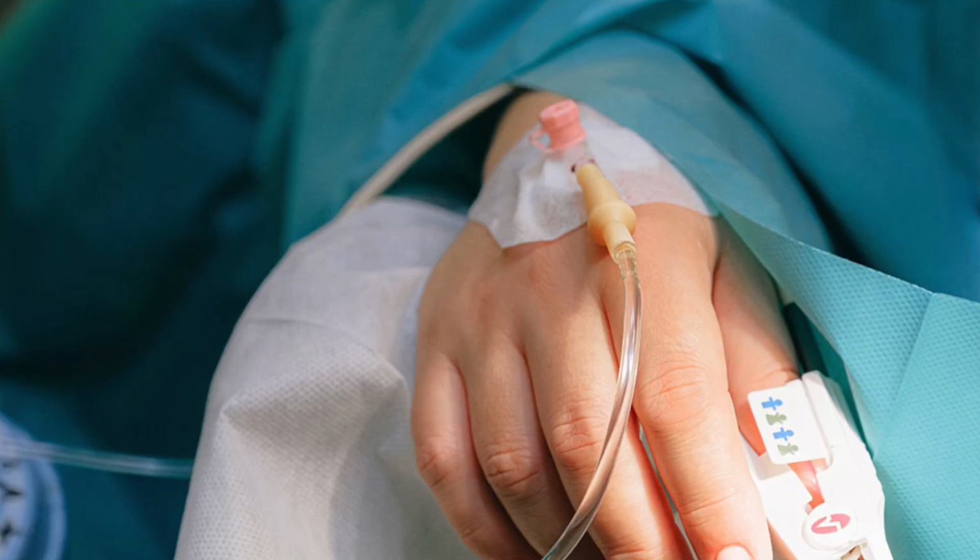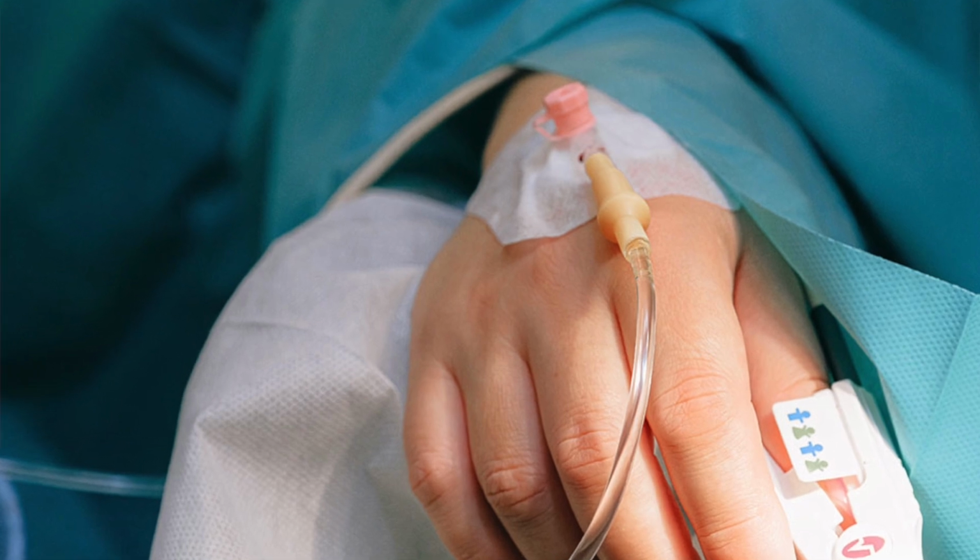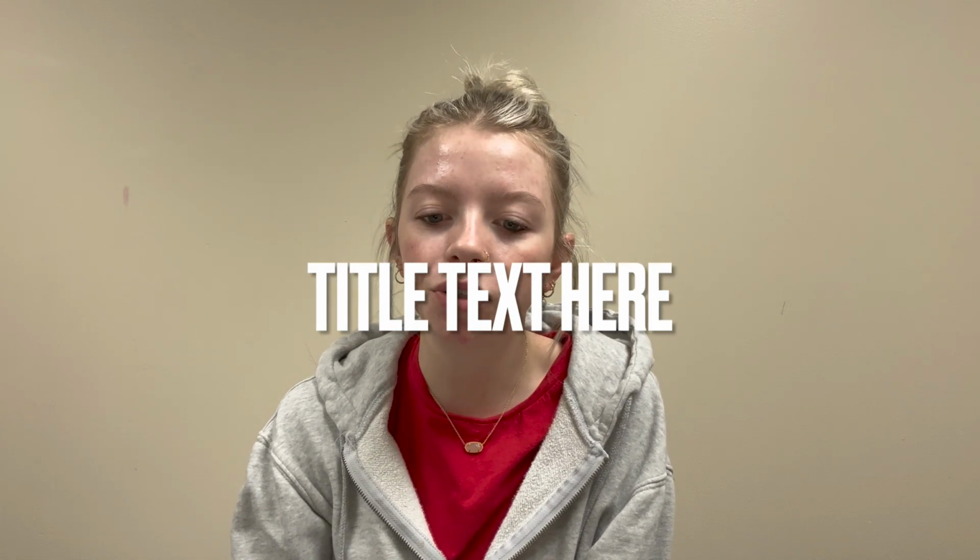Now let's talk about what to expect when receiving a PET scan. You'll receive an IV injection of a safe amount of a radioactive drug. After you receive the injection, you'll have to wait for the medicine to move through the bloodstream and absorb into all of your organs and tissues. You lay on the exam table that will slide into the scanning machine. Just like any other medical imaging machines we have learned about in this series, you'll have to stay very still so the images don't turn out blurry.